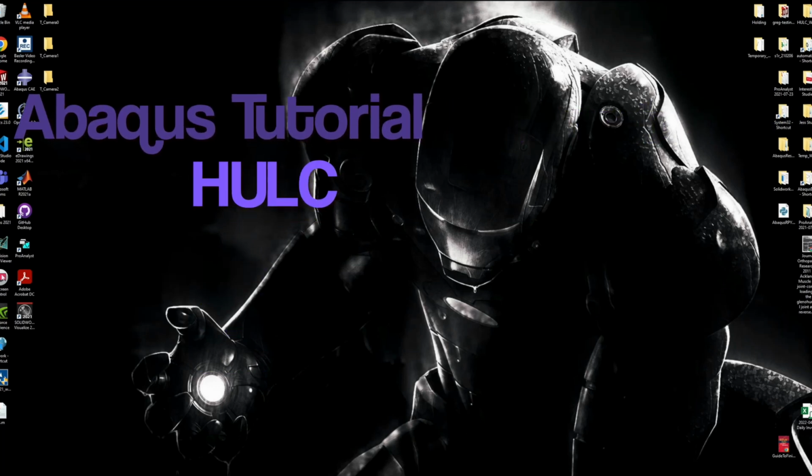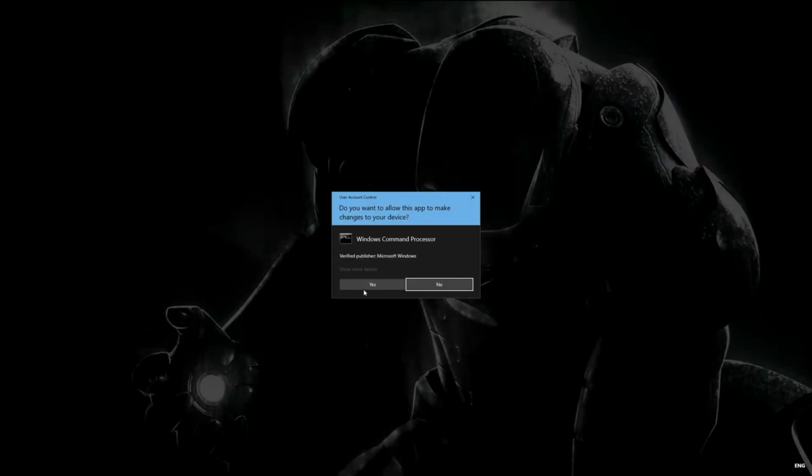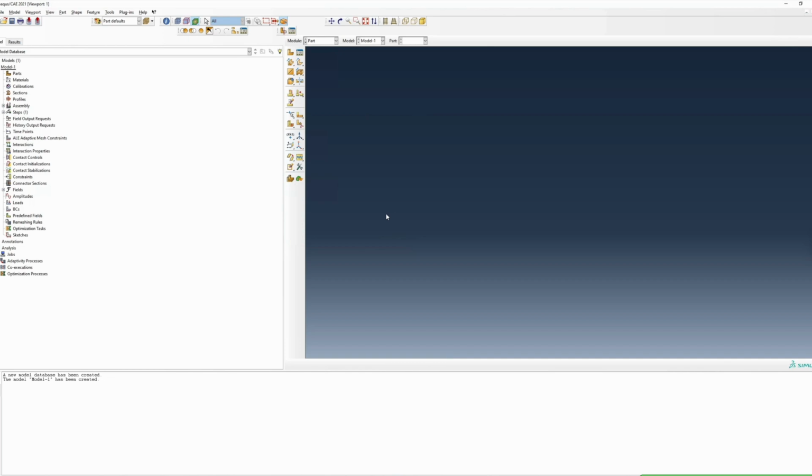Okay, welcome everyone to yet another tutorial on how to run biomechanical implant evaluations using SolidWorks, Mimics, and Abaqus. In this video, similarly to the positioning a humeral implant in a Mimics bone model video, we're going to be essentially doing a step-by-step instruction guide on how to bring a SolidWorks-positioned implant into Abaqus, how to apply material properties using Mimics, and then bring those material applied models back into Abaqus for analysis.